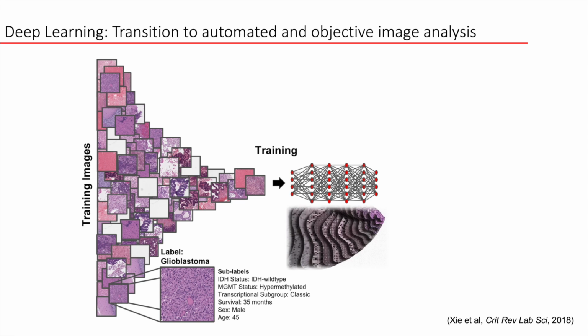So you can see here in this pathology example, you would have these snapshots of different tumors that are labeled with different values. And by running those through this algorithm, the algorithm could analyze groups of images from a specific class, pixel by pixel, and try to find specific pixel patterns that are common between the images of that class.